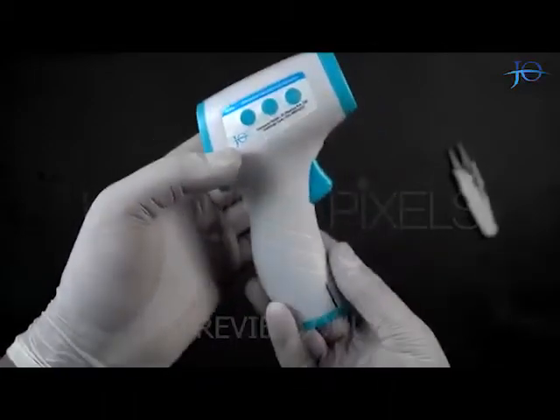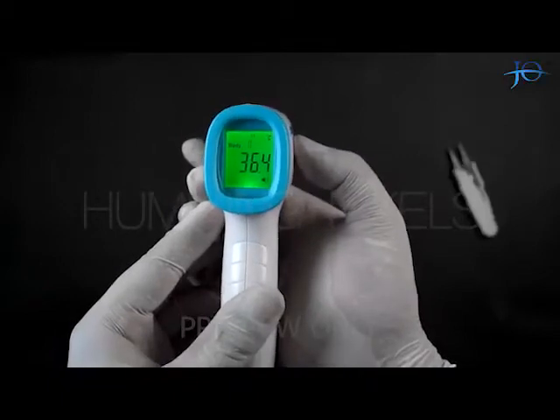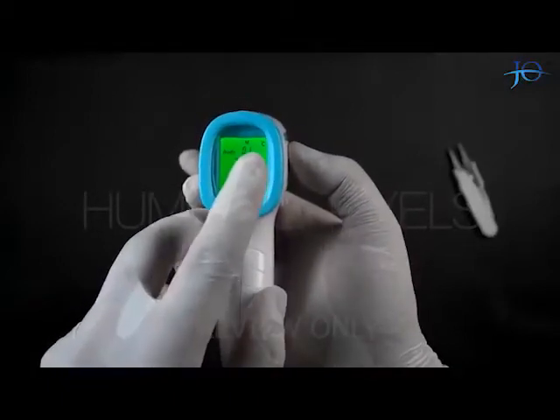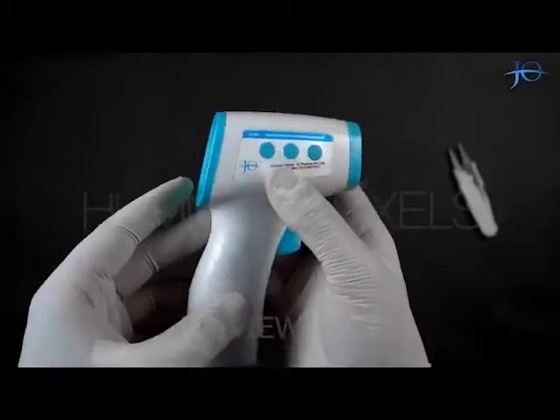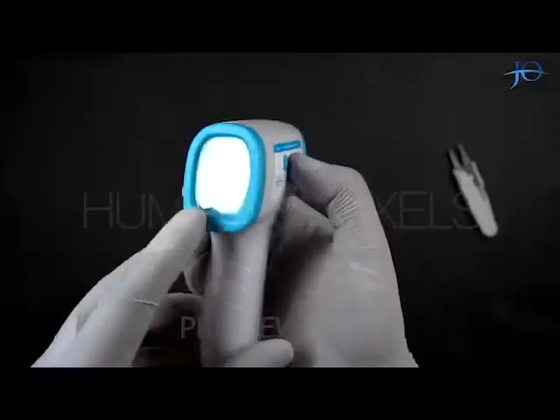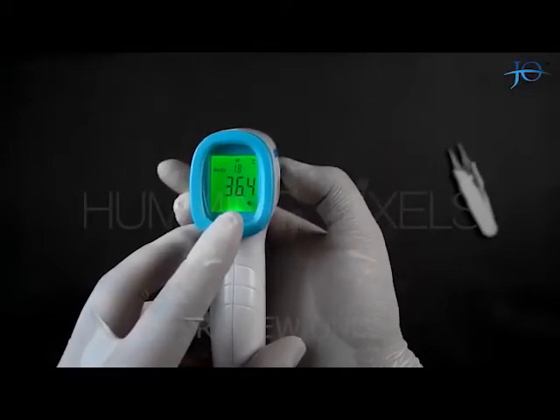Now we will see how the other buttons work. If we press the Set button, we can change the temperature unit from Celsius to Fahrenheit and vice versa. We have another button in the middle which is for memory of the temperature readings taken by the gun, which shows us the last 20 memories.